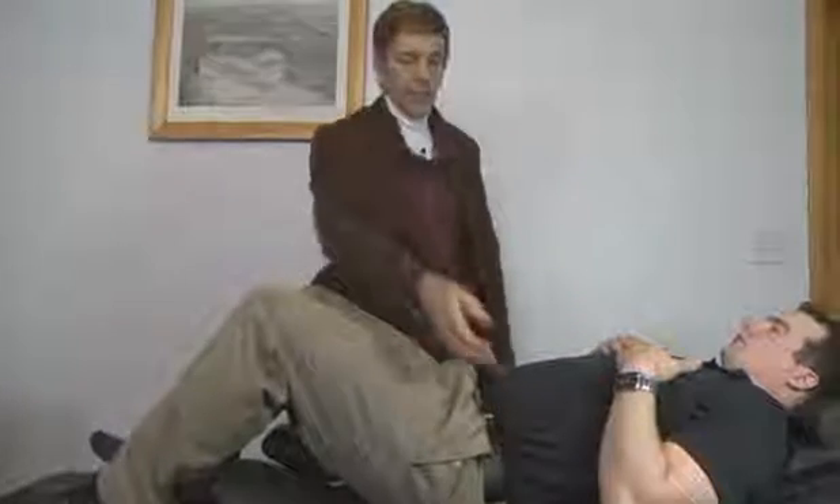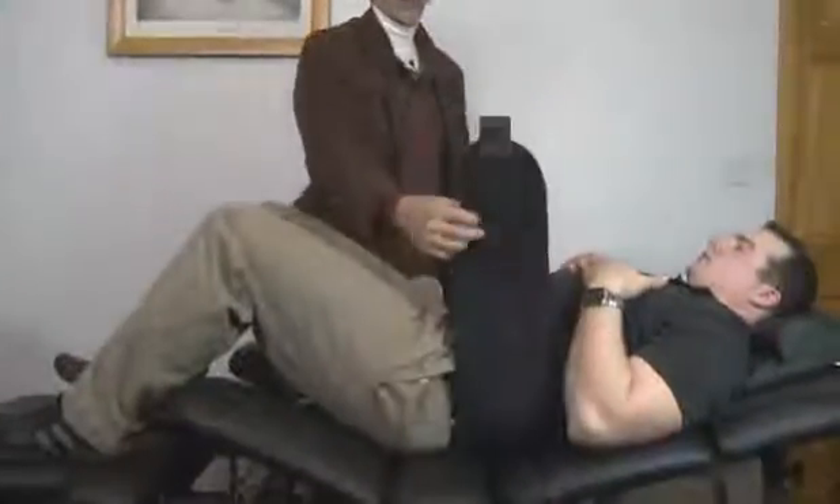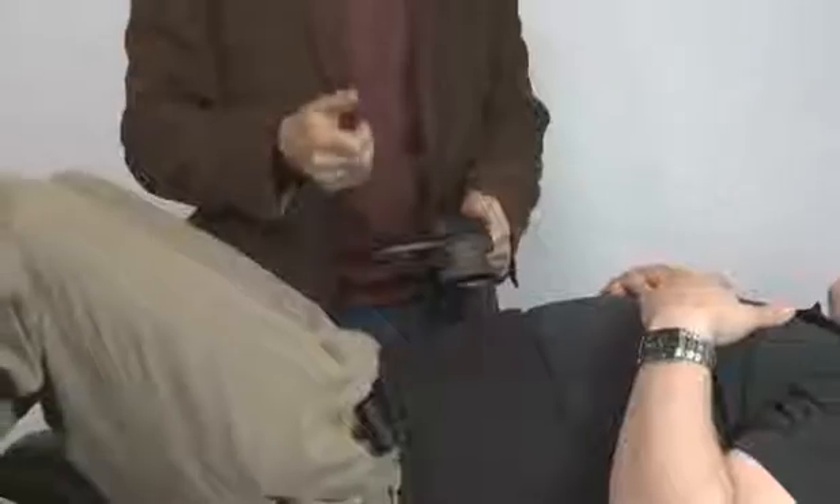This is a new product called the ratchet belt. It utilizes a simple, easy-to-use two-inch ratchet, which allows us to achieve infinite tightening configurations on patients where we can't get sufficient belt tightening by manual means.